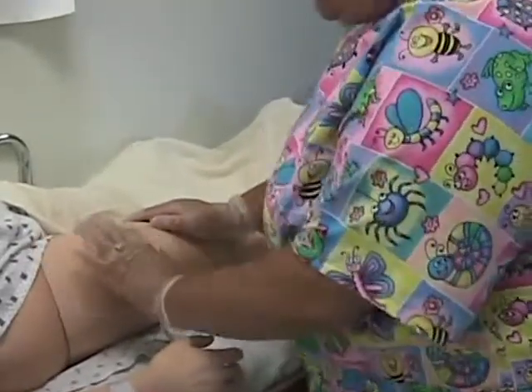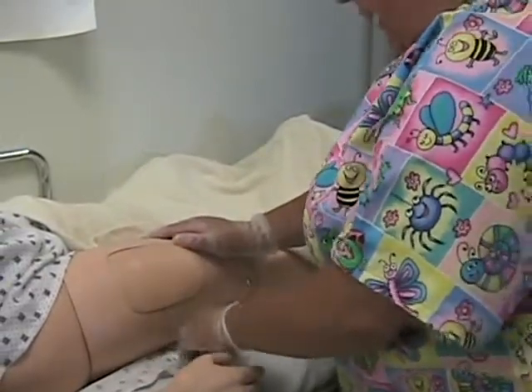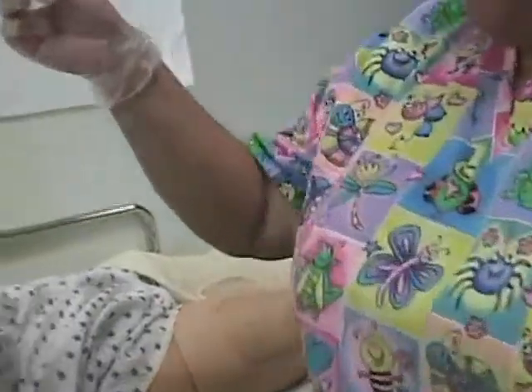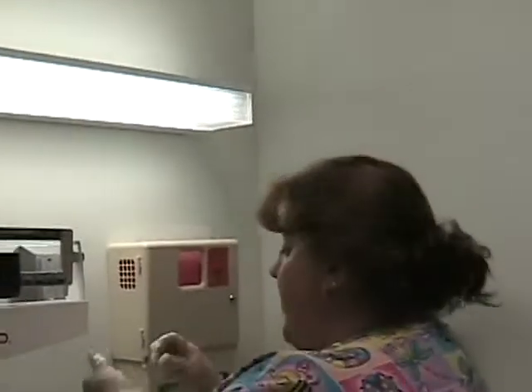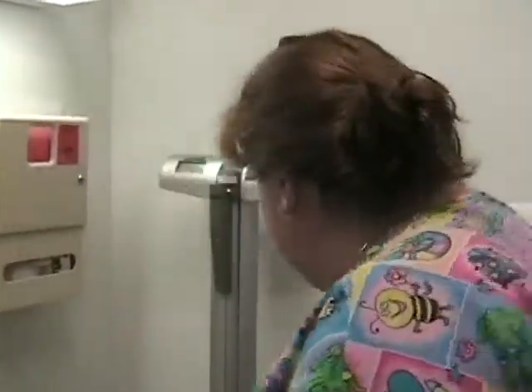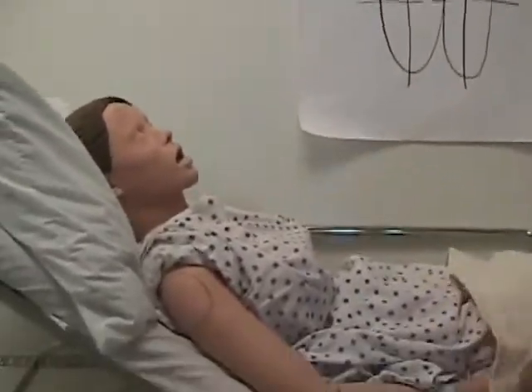When we are finished checking for blood, go ahead and grab all of your garbage. Take that into the needle box or sharps container. Then you take your garbage, wrap it up in your glove, take this one off, wrap that one in your glove, and throw it away. Without leaving your patient's side, you would then go ahead and make sure that they're comfortable. Ask them if they need anything.